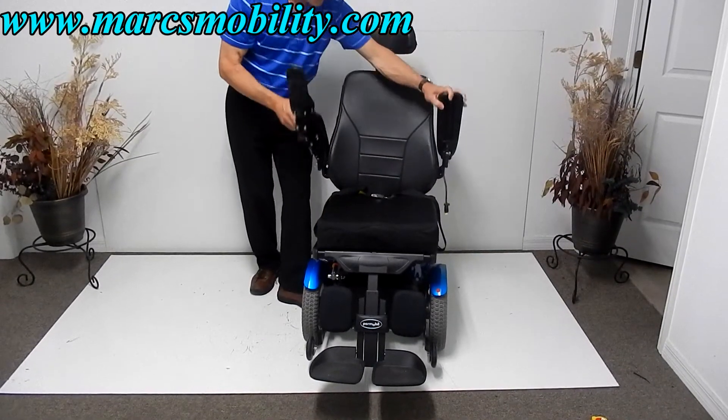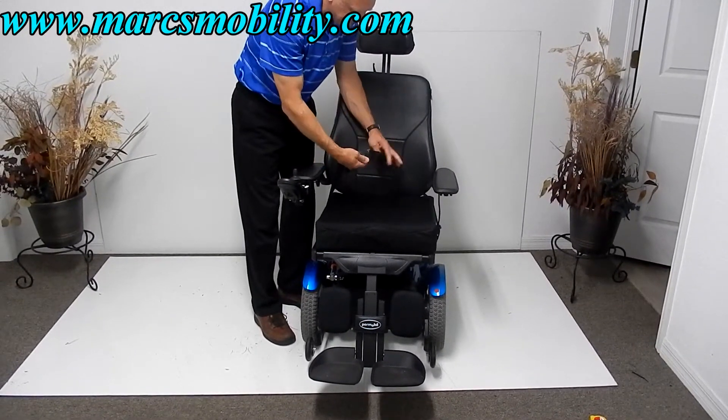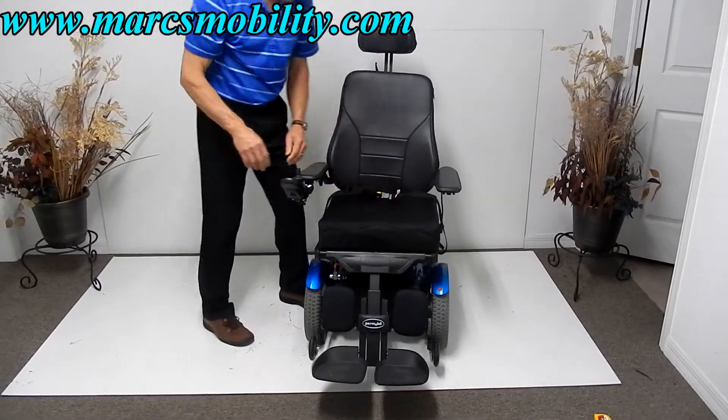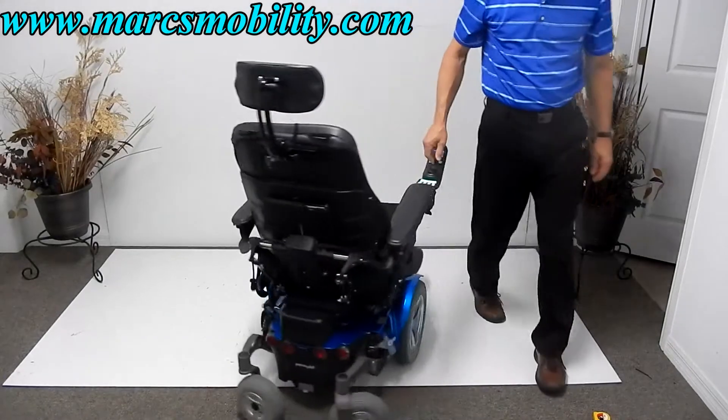The arms do go up. You've got your safety belt as mentioned. The turning radius on this chair is very nice — it turns pretty much on itself.